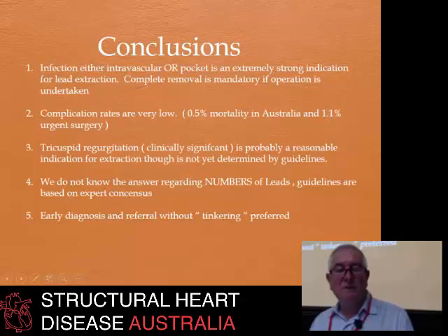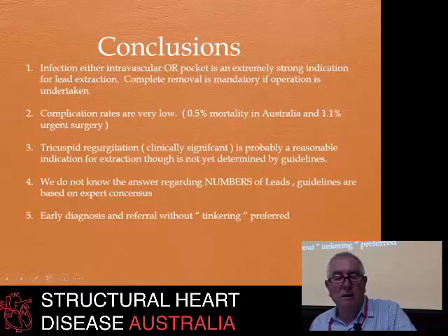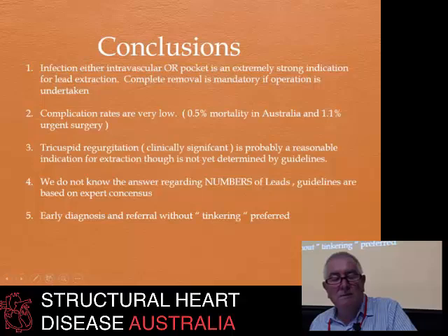Conclusions, therefore: infection, whether it's intravascular or pocket infection, is an extremely strong indication for lead extraction, and complete removal is mandatory if you hope to cure the patient. Complication rates in Australia are extremely low, and the data's been well collected over many years by the lead extraction committee and been looked at quite seriously. And compared to the overseas rates, this is probably less than half of what's quoted in most areas.